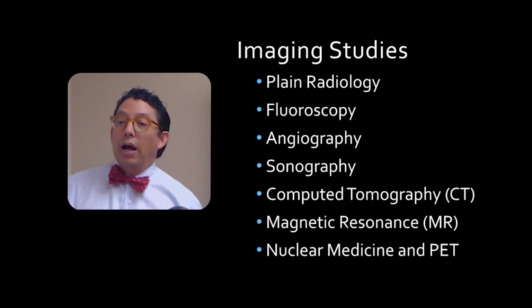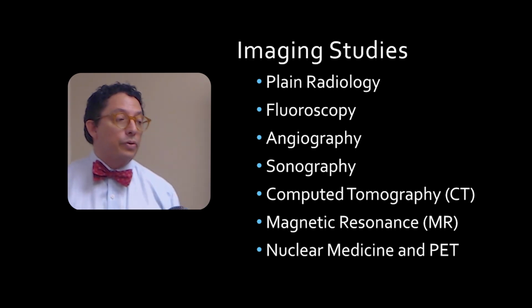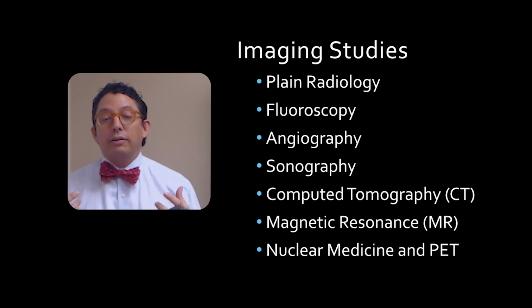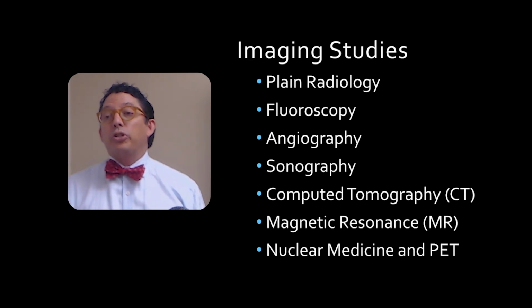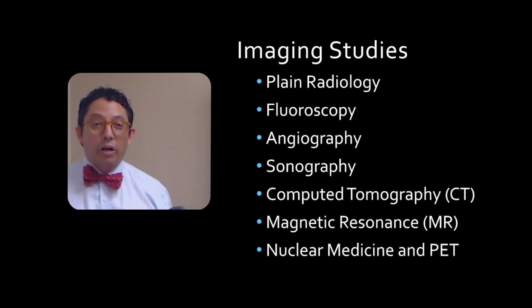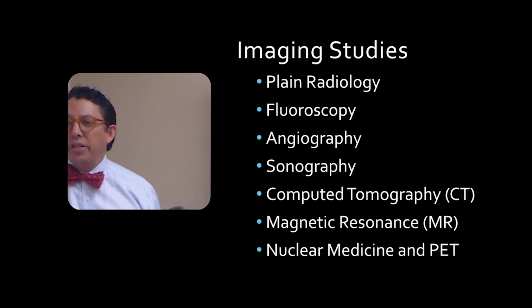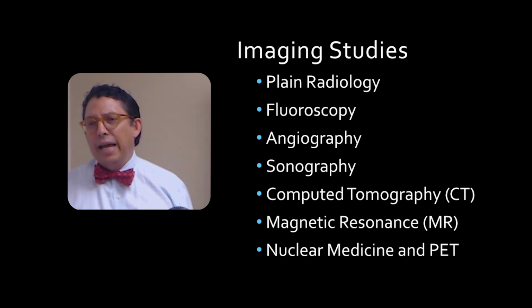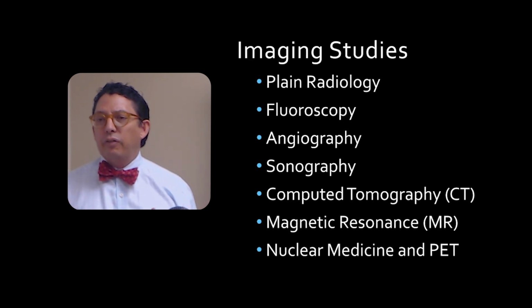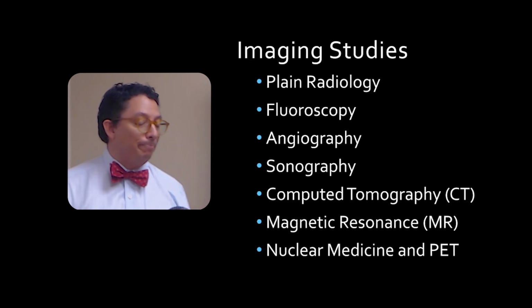And through MRI. MRI utilizes magnetism to transfer energy into the human brain, or the body, and the body will then give back that energy. If you tweak it a little bit, we're going to see that in physics in this course, you can identify intensities of signal inside of the body and reconstruct images.